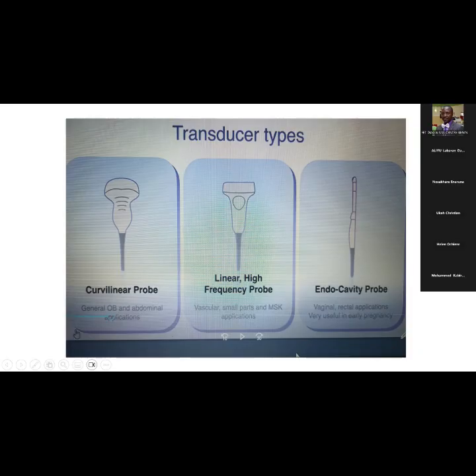And so, of course, the endovaginal probe, which has become the second stethoscope of the obstetrician and gynecologist. So you're going to find more of the curvilinear probe or convex probe and the endocavity probe, the transvaginal probe in your practice.